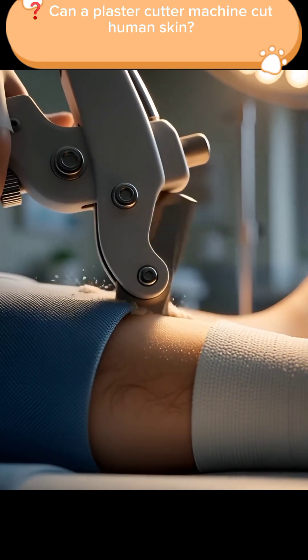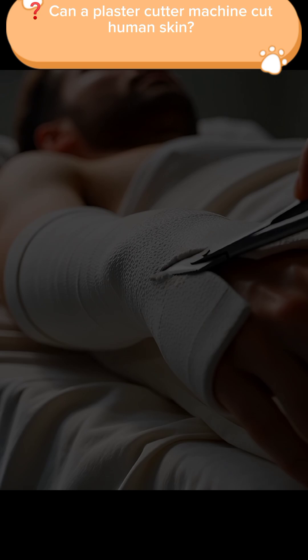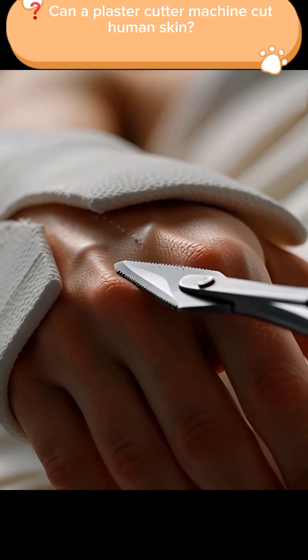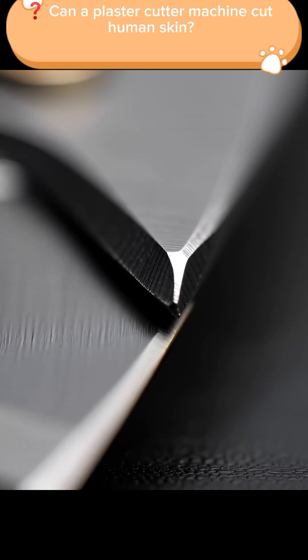Have you ever wondered why a plaster cutter can slice through a cast so easily, yet it never cuts human skin? At first glance, it looks like the tool should split your hand in two just as it cuts the plaster. But here's the real reason why it doesn't.